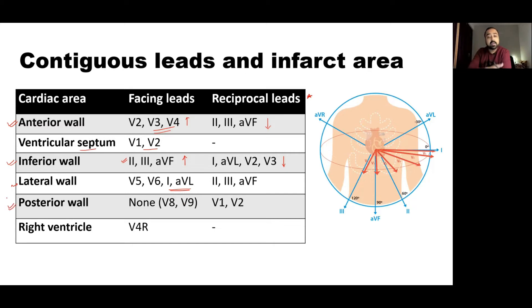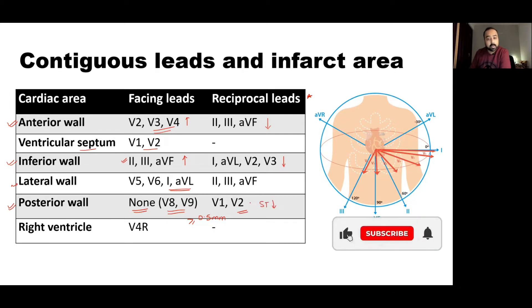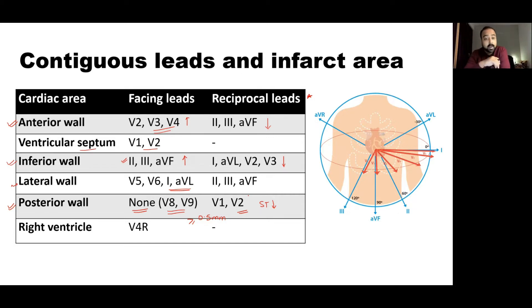There are no leads placed posteriorly, so no standard ECG lead directly views the posterior wall. However, extra leads V7, V8, V9 can detect posterior wall ST elevations — even 0.5 mm is enough for diagnosis of posterior wall MI. In a standard 12-lead ECG, V1 and V2 are the reciprocal leads for the posterior wall. If you see ST depression in V1 and V2, have a high index of suspicion for posterior wall myocardial infarction.